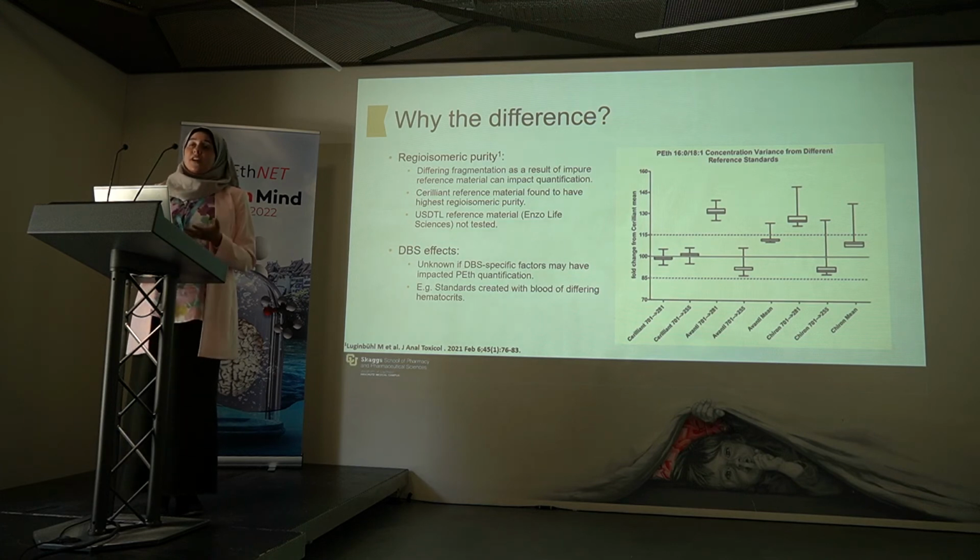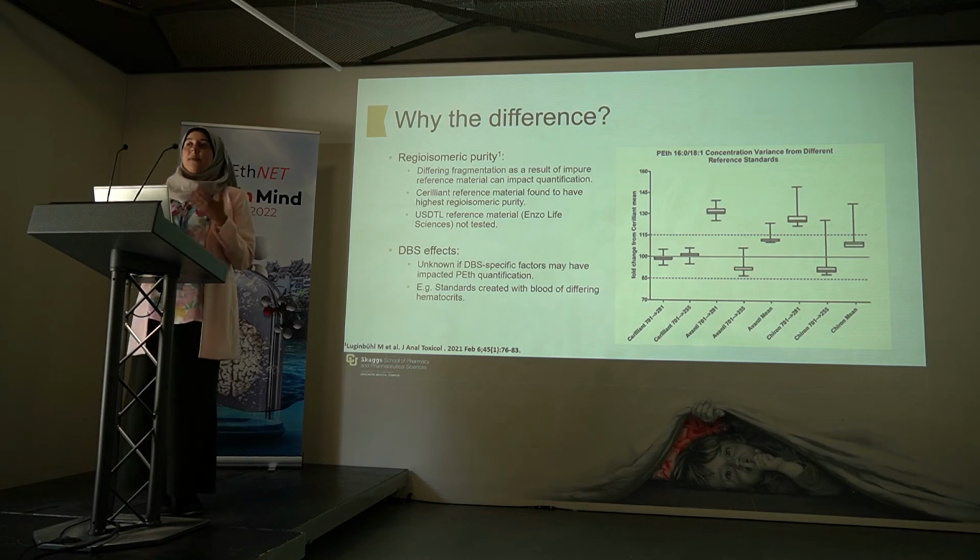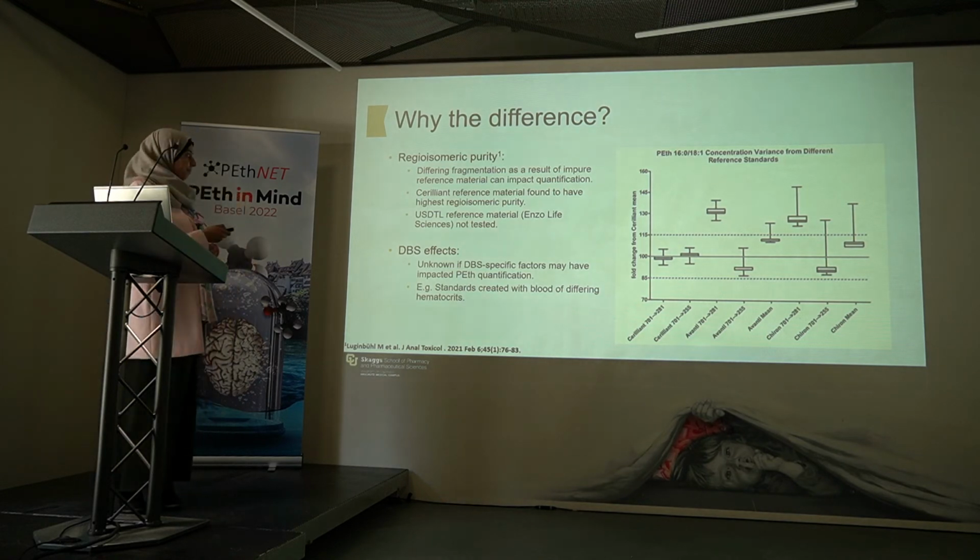seeing. So, for example, based on the hematocrit effect data that we found in our validation, we hypothesized that if the standards by our lab and the USDTL were created from blood of different hematocrits, then this could also be a source for those differences.